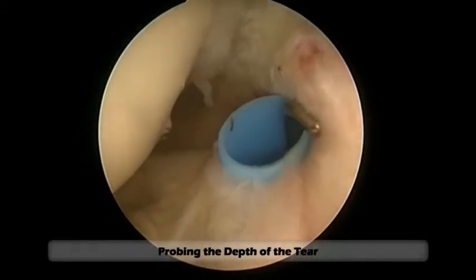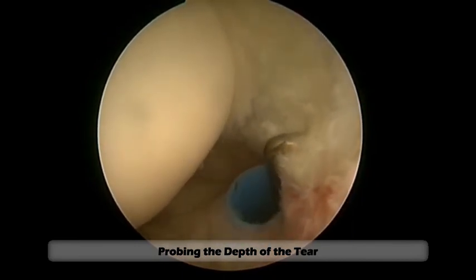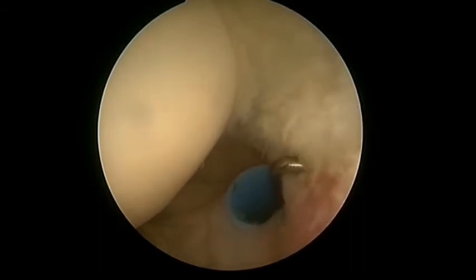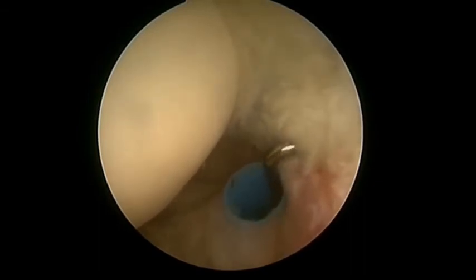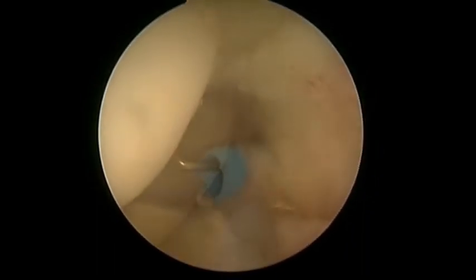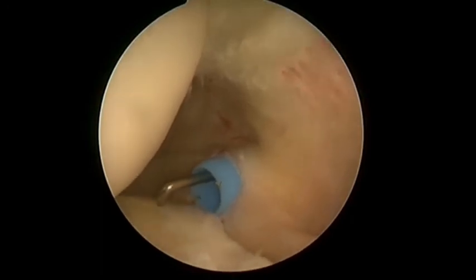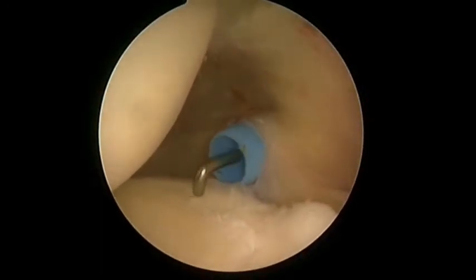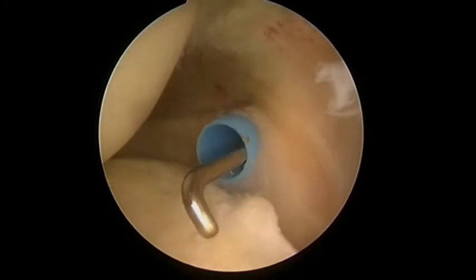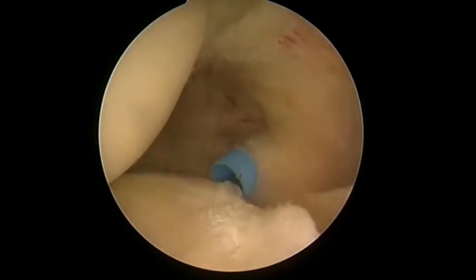The depth of the rotator cuff tear is evaluated and the stability of the labrum is again assessed. Once the offending pain generator is addressed arthroscopically, the athlete is then placed into a highly structured thrower's rehabilitation program prior to returning to play.